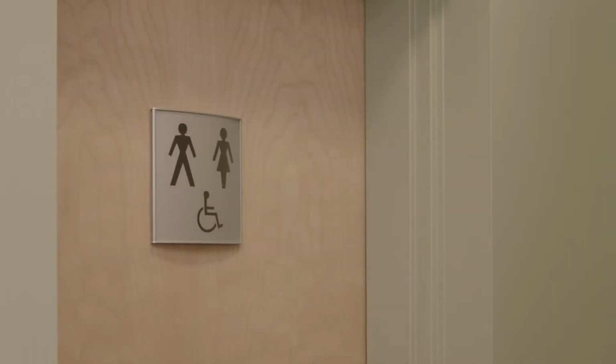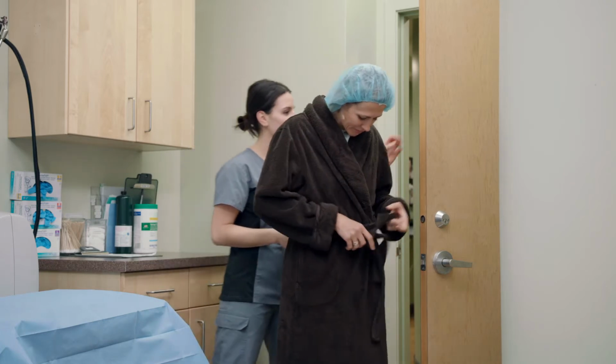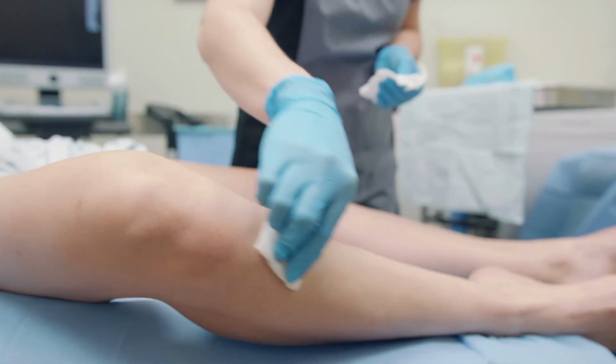Just before getting into the surgical suite, we recommend you use the washroom. And then we will walk you down the hall to our surgical suite, where you will be asked to stand on a sterile blue pad. The nurse or assistant will take your housecoat from you. Your blue booties will also be removed. It's a sterile or clean environment, so we ask you just not to touch anything else and keep your hands at your sides. We're going to ask you to hold your gown at waist height, and you'll be cleaned all the way along your legs.